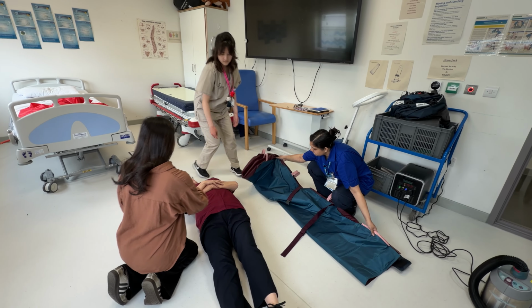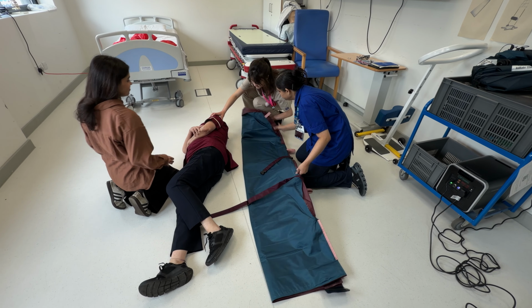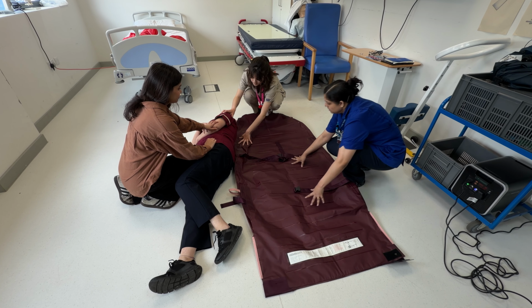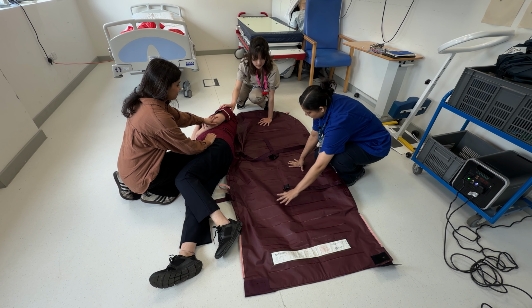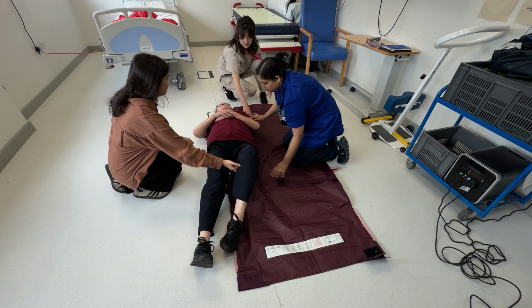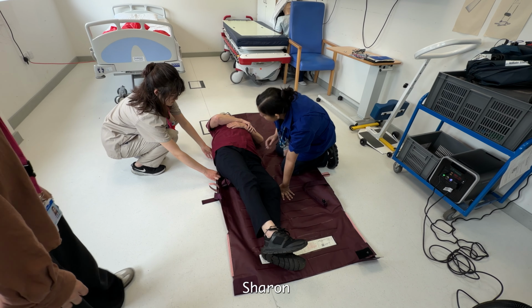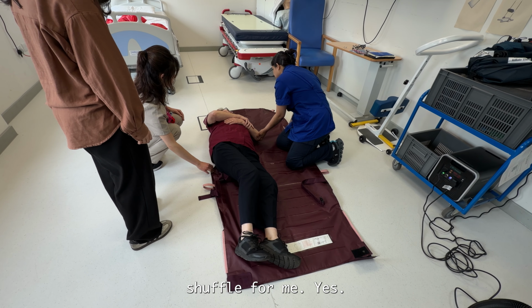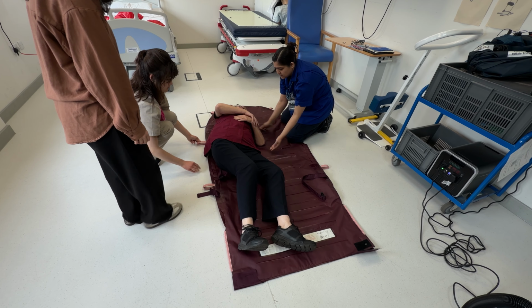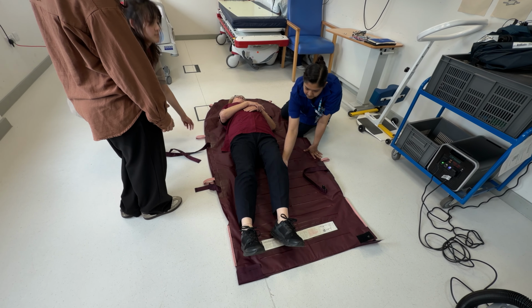Could you turn to the side, please? On your back. Let's get your legs on there. Sharon, will you be able to do a little shuffle for me? Yes. Would you shuffle towards me. One more shuffle and we'll be in the center. Okay. Let's get your legs this side.